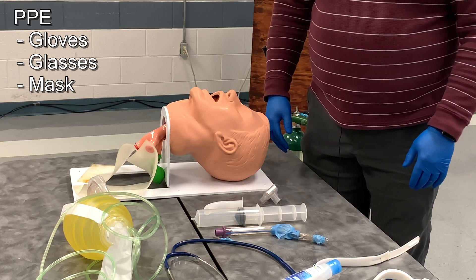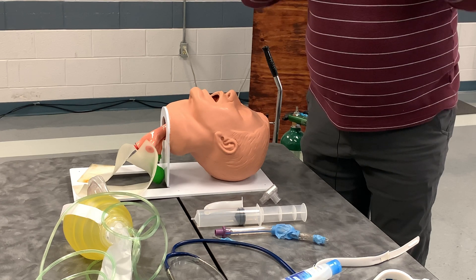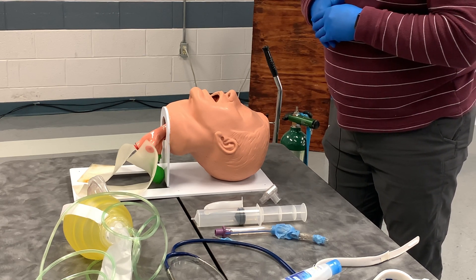To begin the station, I have my appropriate personal protective equipment — my gloves and glasses. I am on scene with a patient that is apneic but has a strong carotid pulse, and no other life threats are identified.